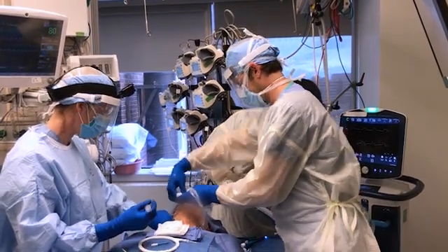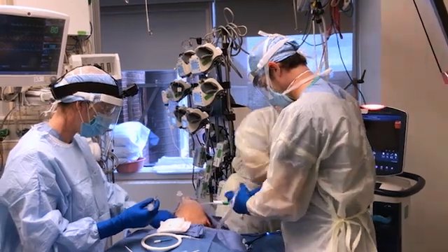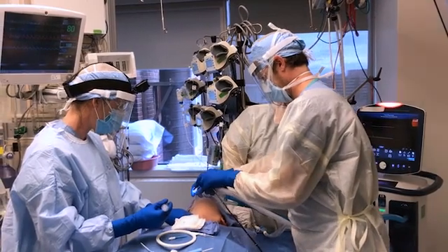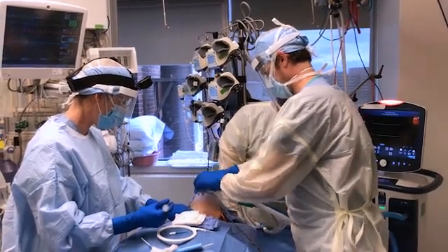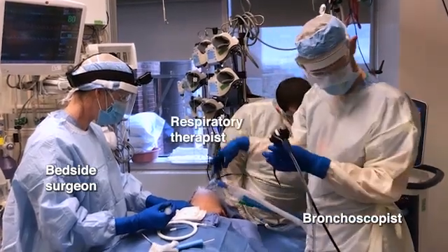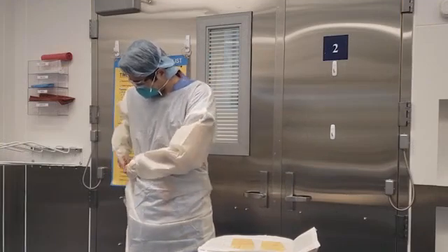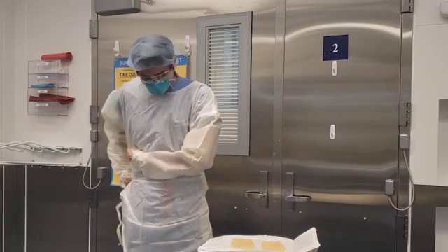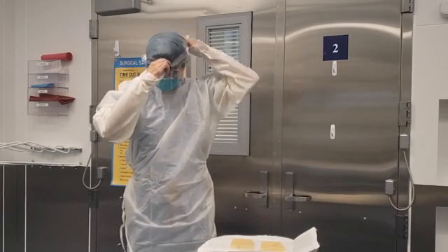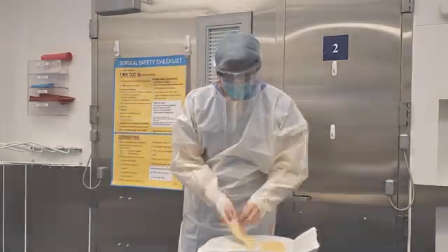Minimizing the exposure of healthcare personnel to aerosol-generating procedures is critical when treating patients with COVID-19. To safely perform percutaneous tracheostomy, a minimum of three people must be present: the bedside surgeon, a bronchoscopist, and a respiratory therapist. Percutaneous tracheostomy is considered to be an aerosol-generating procedure, and all persons in the room must be wearing PPE in accordance with institutional policies.